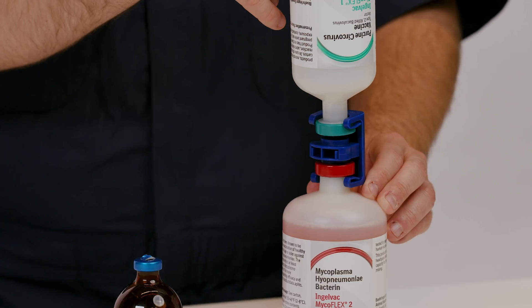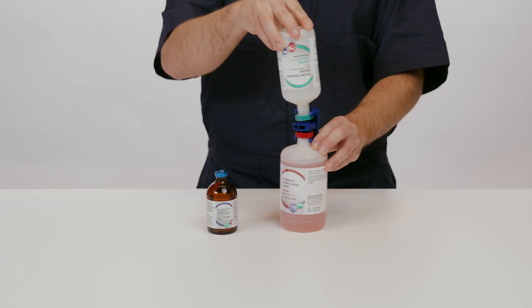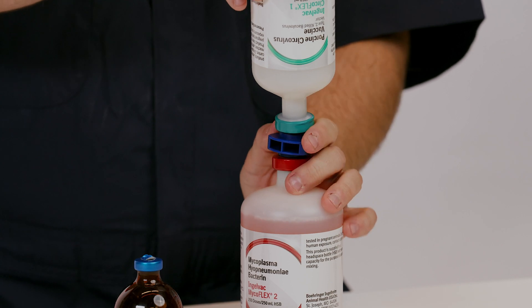Once the IngleVac CircoFlex is fully transferred into the IngleVac MycoFlex bottle, shake gently. Then remove the IngleVac CircoFlex bottle from the transfer spike.